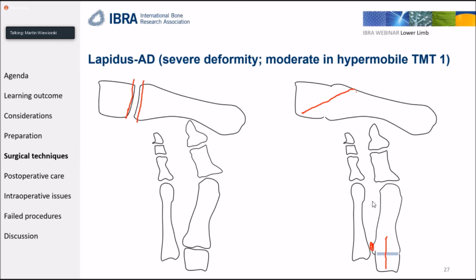Any kind of fixation you put on top of it, and I'm using this Aptus 2.8 plate, is just a dorsal plate which goes into this area. This is secondary. It gives you rotational stability, but the most important thing is the compression by this screw, at least in my opinion.